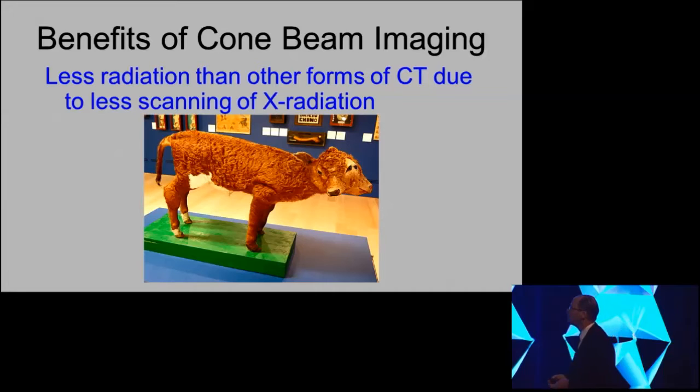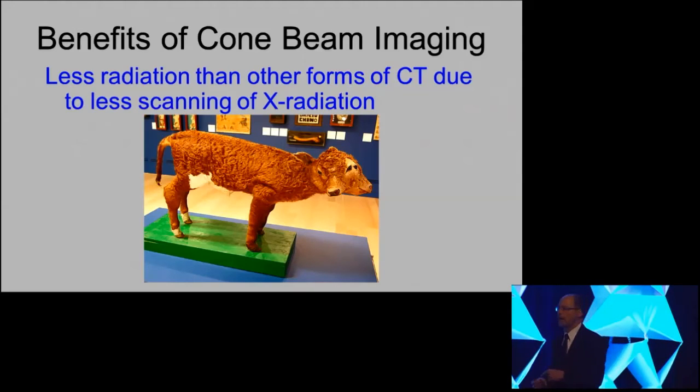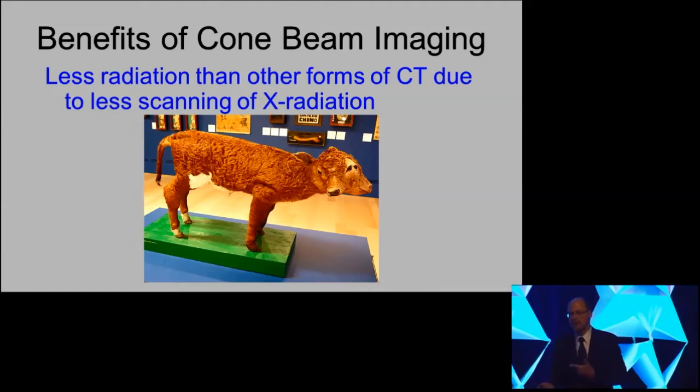And the other thing about what we used to call medical CT is that instead of one flat panel detector or one image intensifier, it's a multi-detector type of system where it takes the data so quickly, sends it to the CPU system, and immediately is re-energized to get data on another area, and it's a much more expensive type of system. They're called multi-detector CT units. So if you're using the terms medical CT or dental CT, I just encourage you to stop, because it's old terminology and it's not appropriate anymore. Just use CBCT or cone beam, then everybody knows what you mean, because that's primarily what dentists use.